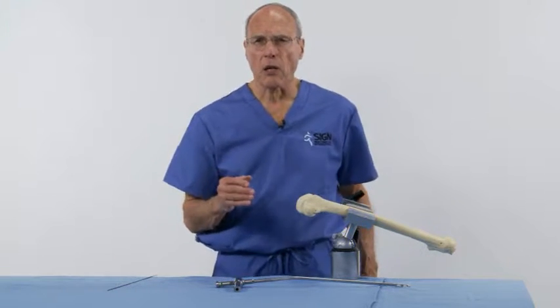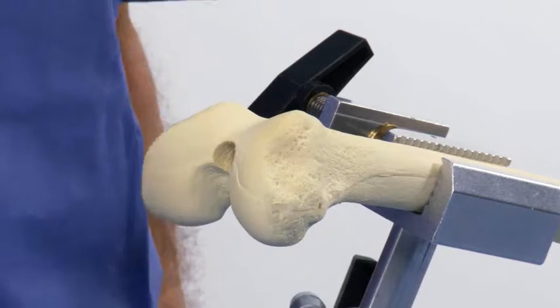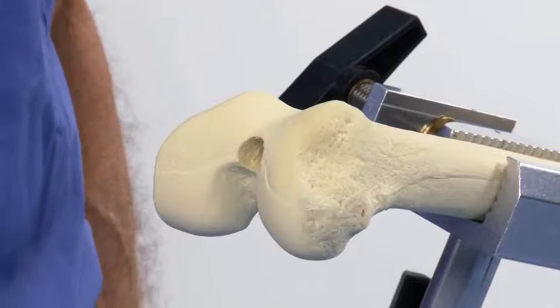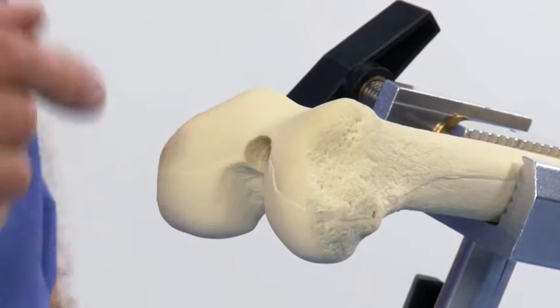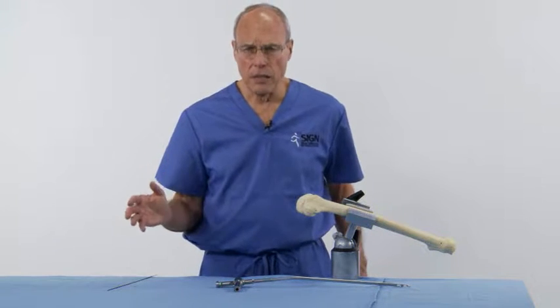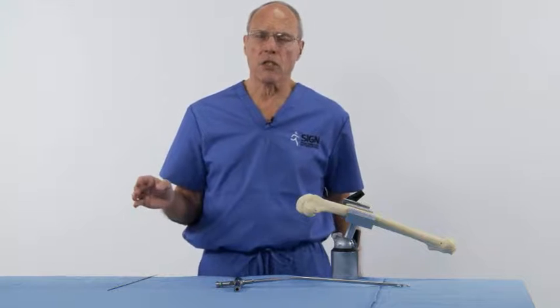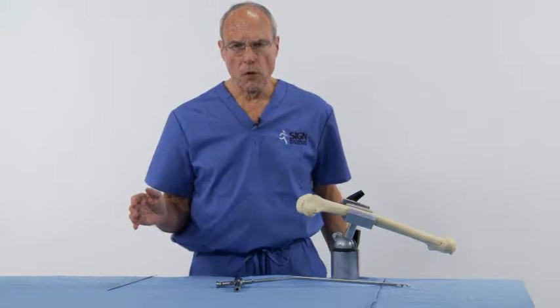Sometimes it's very difficult to manipulate the knee to 60 degrees, and in one instance I made an incision in the patella tendon and removed the medial 1/3 of the patella tendon.